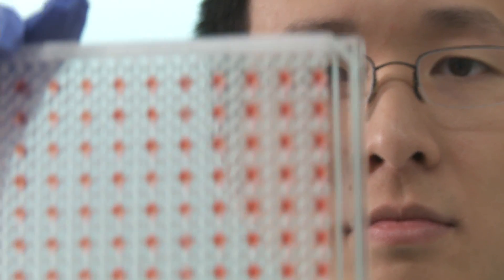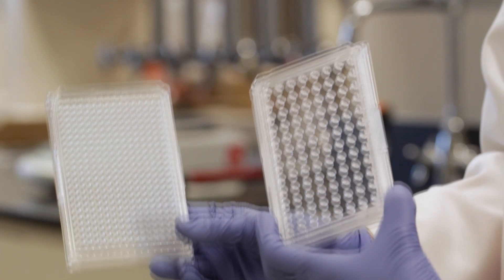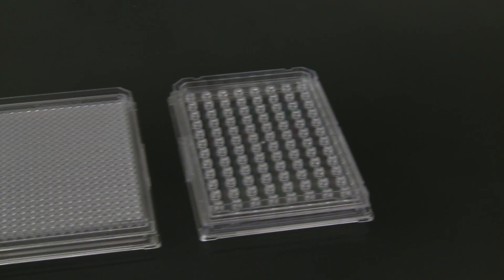3D Biomatrix makes the move to 3D cell culture easy. We have two products on the market: one is a 384-well plate and the other is a 96-well plate.